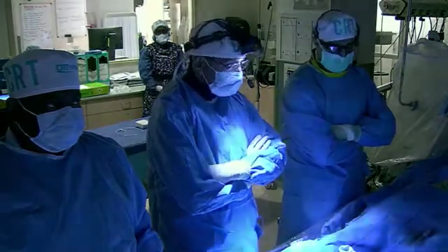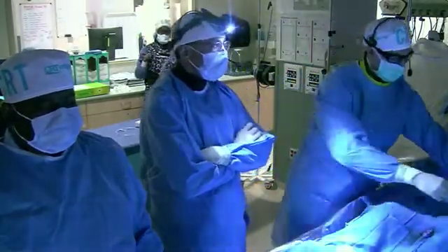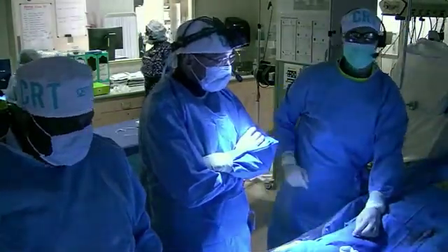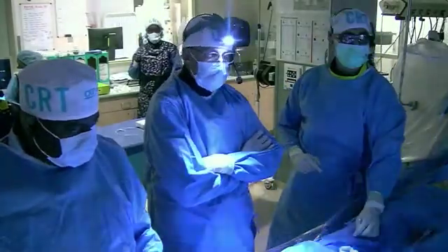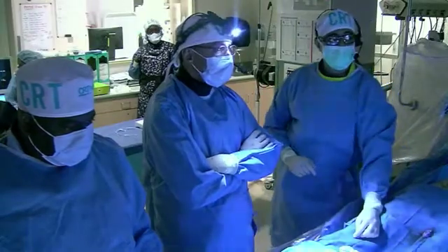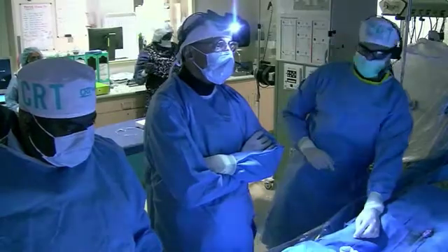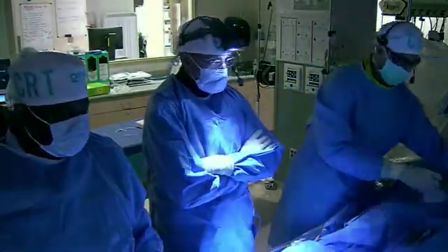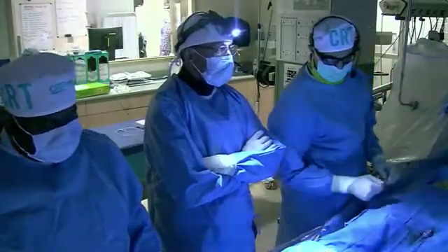If I think a nodule or nothing else, I 100% agree with you. But in this situation where you have superficial calcium on the other wall, I think you could get by with a high pressure balloon. Also, why can't you dilate to begin with? We'll try that. No worries. And see what happens. Otherwise, we can go probably. Sure. You may actually end up disrupting the arteries quite significantly with dissection. I actually like to be more conservative.